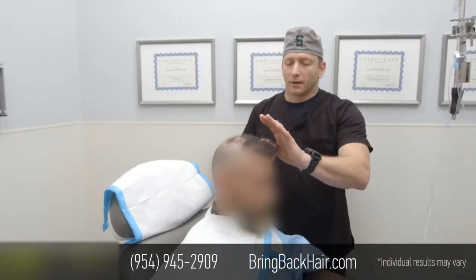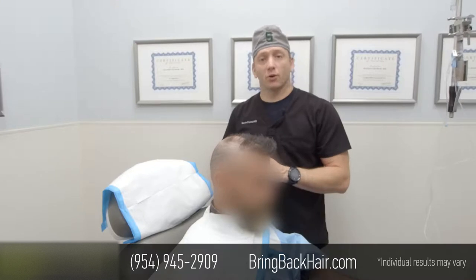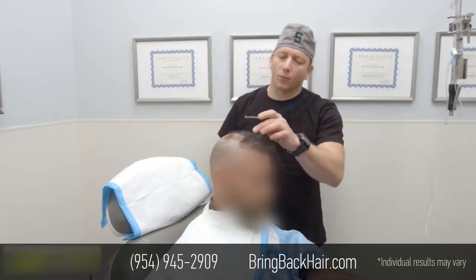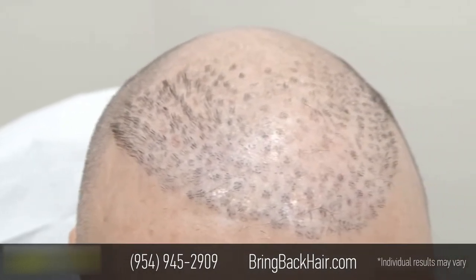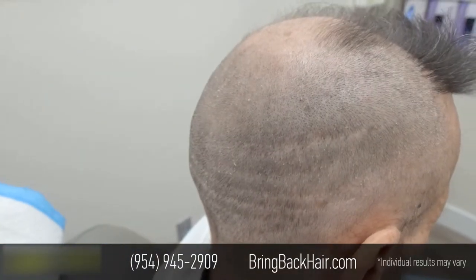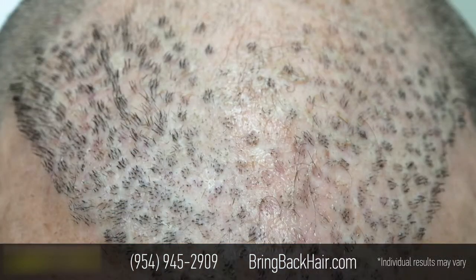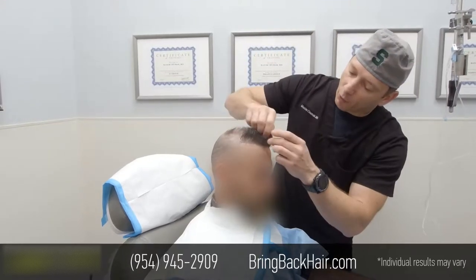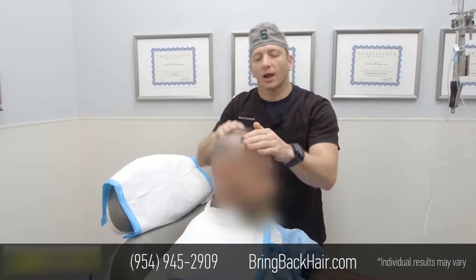We have a unique case today. The patient had his first procedure about 40 years ago. It was a procedure where they utilized large punches — it more looks like a clock here — and they're growing excellent. The hairline is very well distinguished. The only problem is that the hairline is very straight, and you can see the actual plugs. Back then they did not use small punches like we do today, and they all grow at about 70 to 80 degrees to the plane of the head.